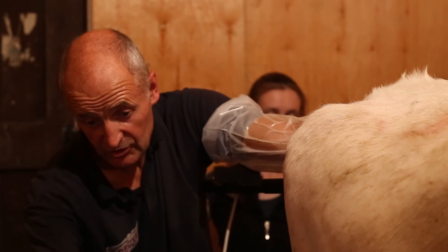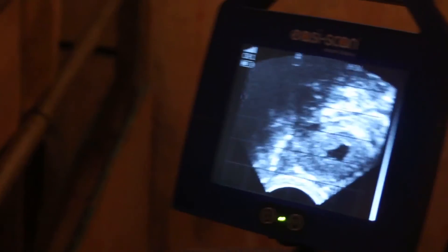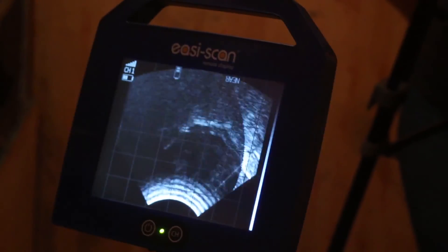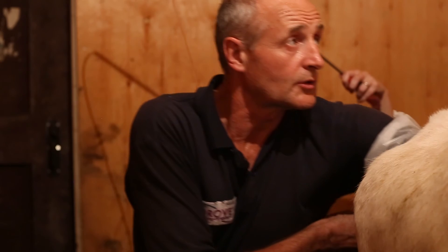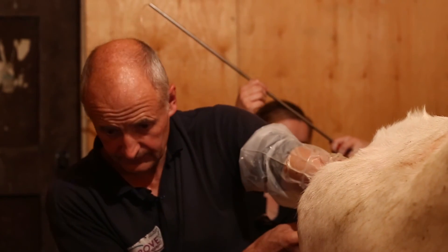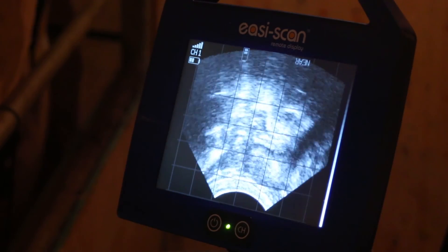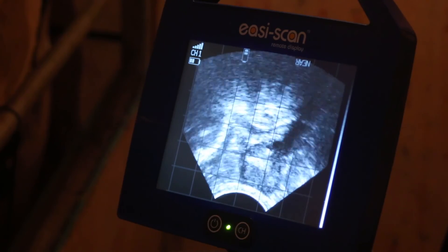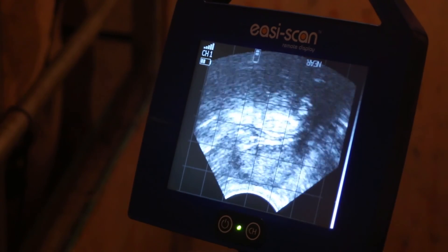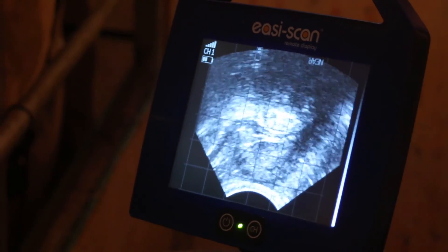Here we have the ovary — just the corpus luteum left. Not many follicles there. That's the left ovary done. I'll just check back over to the right. That's the right ovary in shot now and you can clearly see there's nothing left on that ovary, just normal ovarian stroma with no structures left at all.